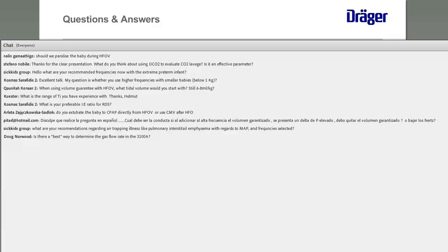But remember that sometimes if you are using a very short inspiratory time, then the pressure generated by the ventilator is not reaching the alveolar area. So if you want to increase the efficacy of ventilation, then sometimes it is better to increase the inspiratory time and go closer to 1:1 rather than increasing delta P.